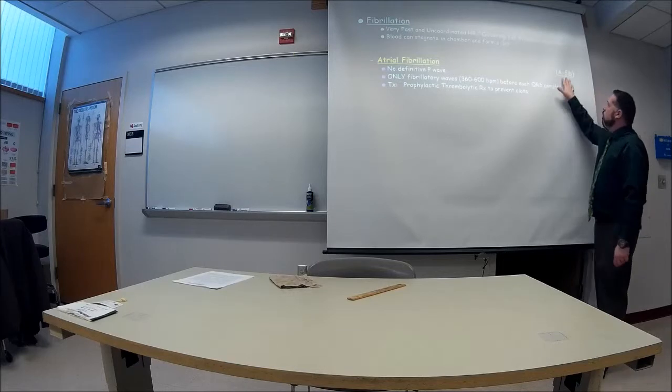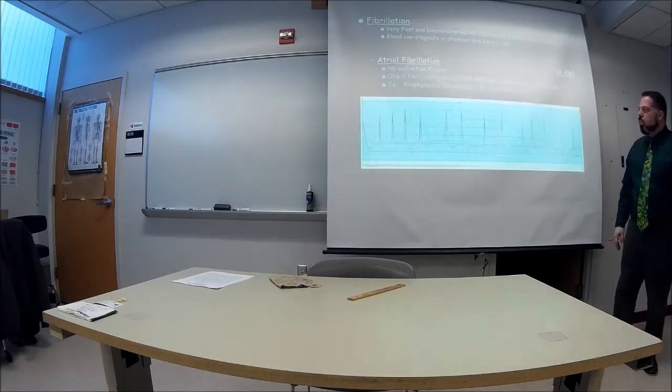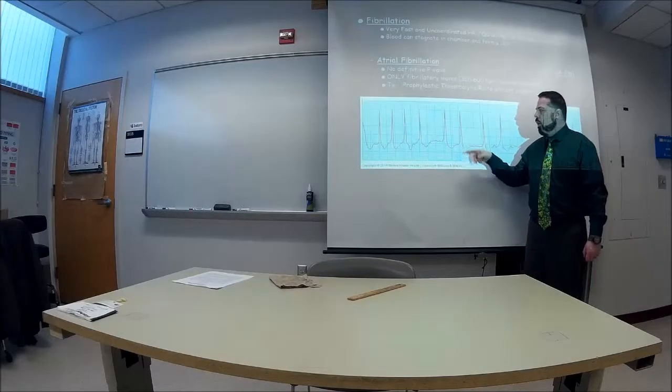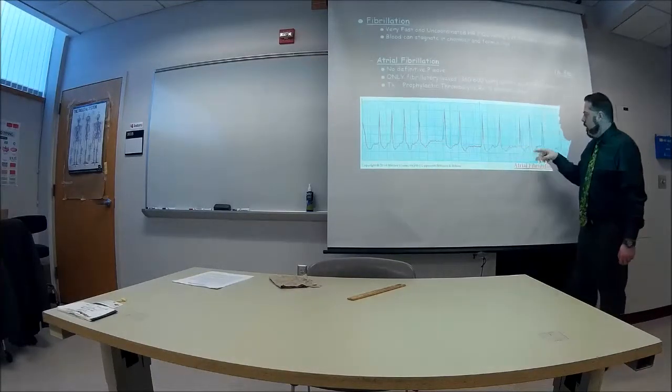So that's what's happening. A lot of people just say AFib for atrial fibrillation, okay? So this is atrial fibrillation. See, the QRSs are quite defining right there. But here, you can't even see the P waves. There's just some quivering that's going on over here.